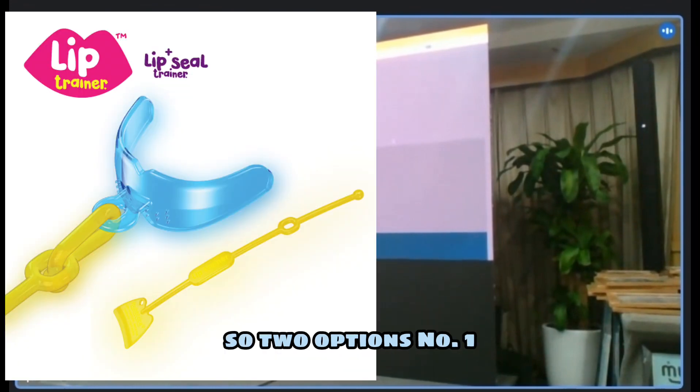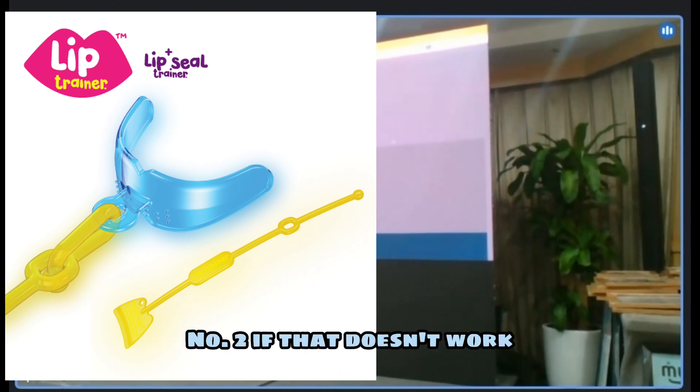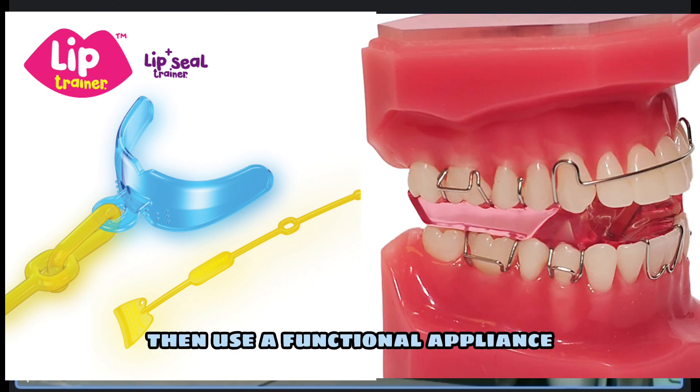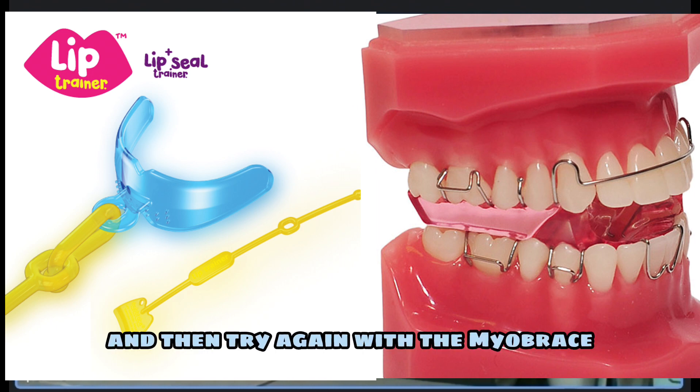So there's two options. Number one, work on the lip trap, then see if the overjet improves. Number two, if that doesn't work, then use a functional appliance, reduce the overjet to, say, seven or eight millimeters, and then try again with the my brace.